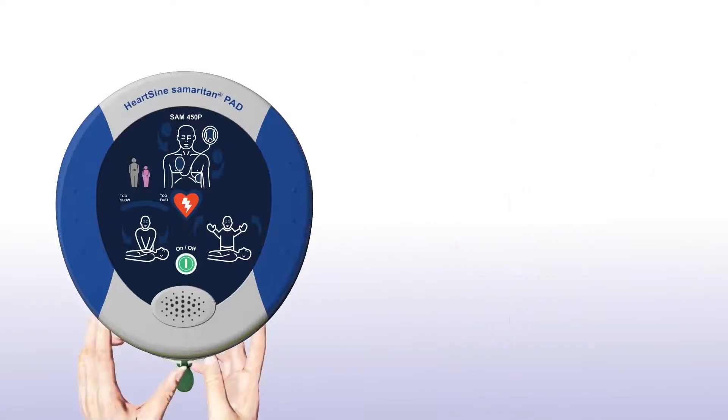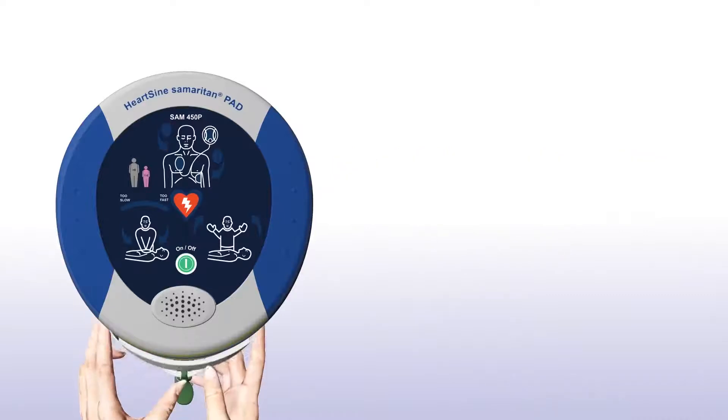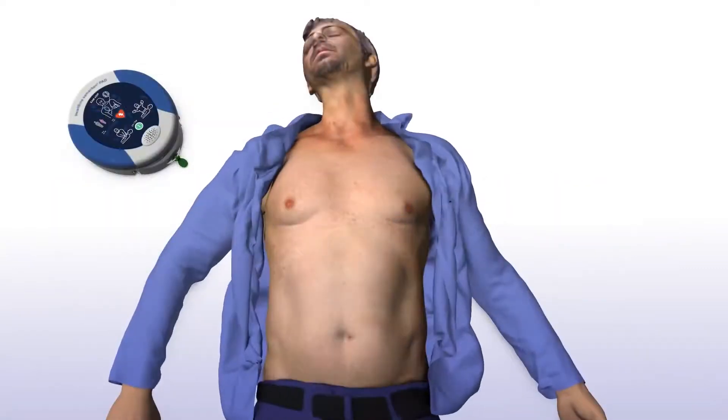If the patient is a child between 1 and 8 years of age, you should ensure a pink paediatric pack is installed. If a pink paediatric pack is not available, you may use the grey adult pad pack instead. The device will prompt: "Adult patient. Call for medical assistance."